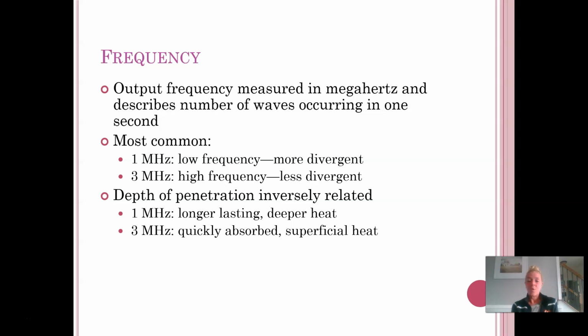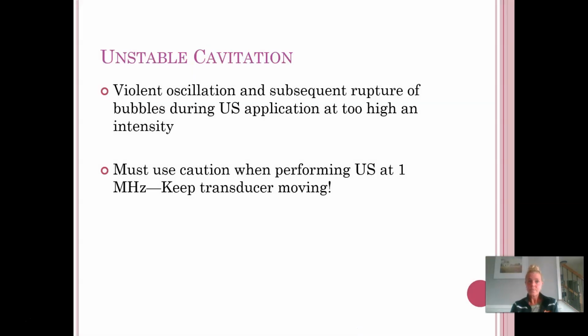As we get into lab, we'll go over a lot of different examples and how to determine, am I going to choose 1 megahertz or 3 megahertz for my frequency? But frequency is one of the settings that you do need to set into the machine.